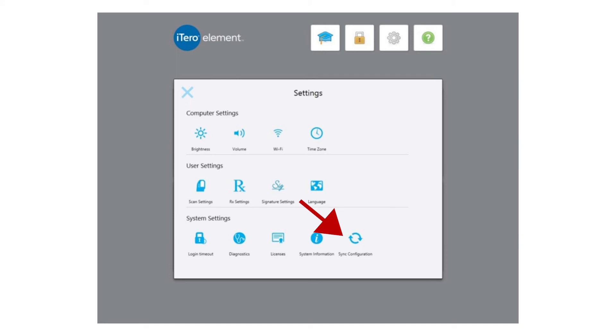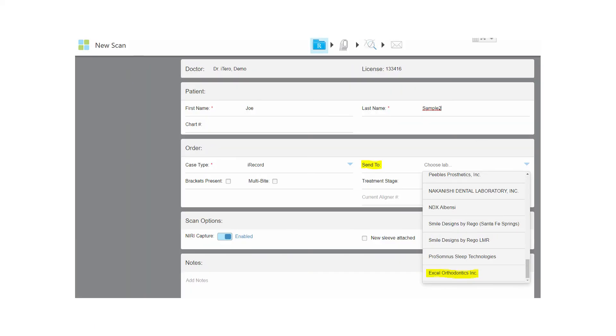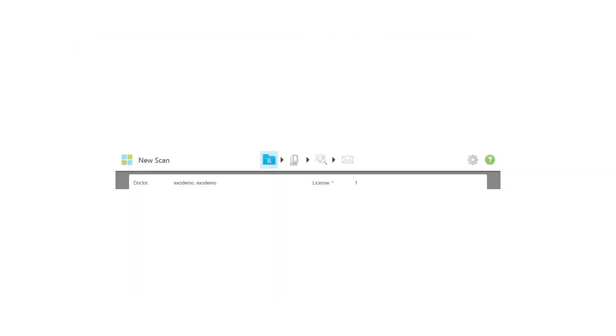Tap the X in the upper left to close the settings screen. Close the lab dropdown and reopen it to refresh the list to see your new lab.